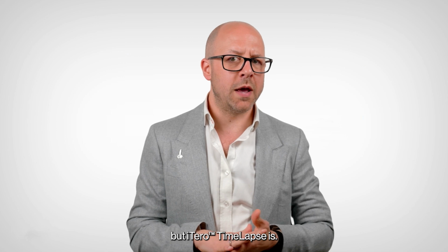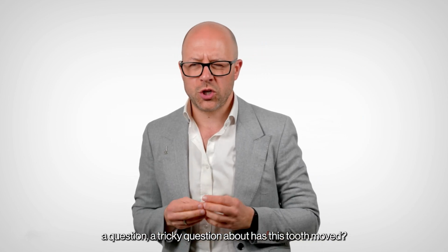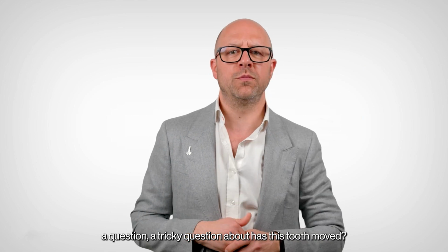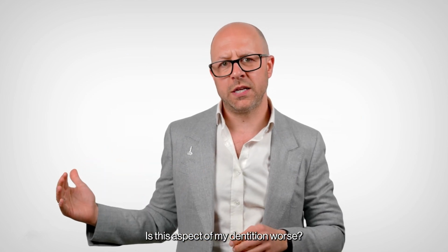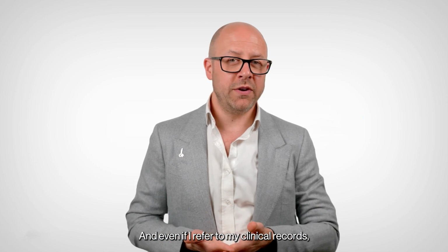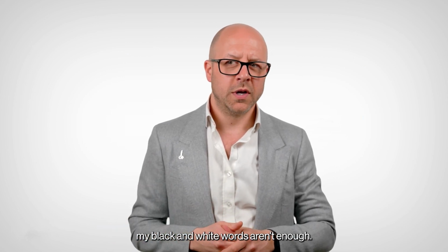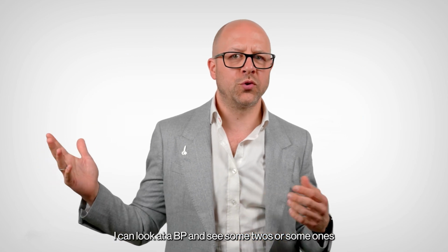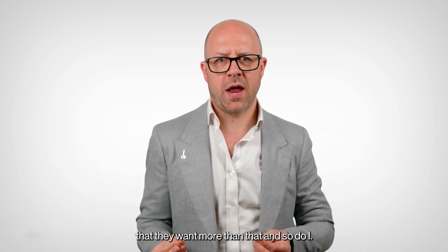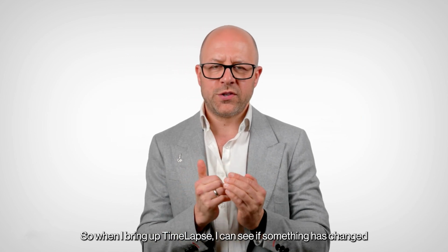But iTero time-lapse is. And that means when a patient asks me a tricky question about, has this tooth moved? Is this aspect of my dentition worse? I don't have to pluck an opinion out of thin air. And even if I refer to my clinical records, my black and white words aren't enough. I can look at a BPE and see some 2s or some 1s, but they want more than that, and so do I. So when I bring up time-lapse, I can see if something has changed.